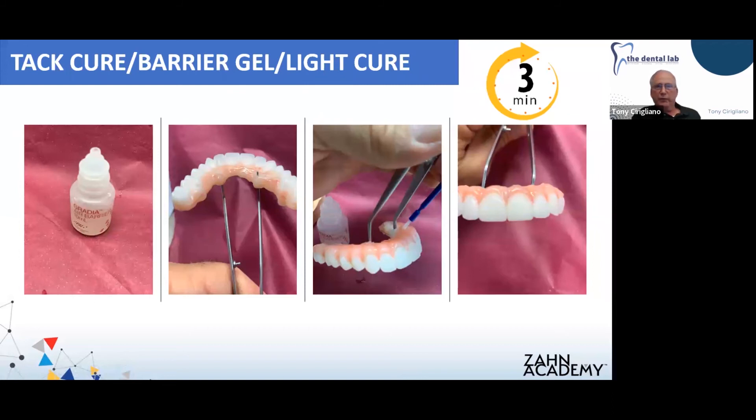Before it goes into the Lab-A-Lite for curing, you're going to take some air barrier gel and apply a thin coat over everything you've just applied — cover all your pink — to prevent the oxygen inhibition layer from forming on the bridge during the curing. Then we go into the Lab-A-Lite for three minutes.